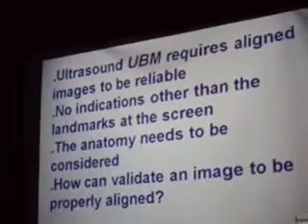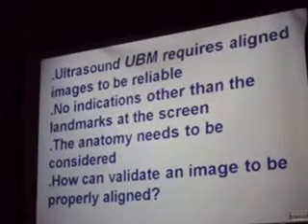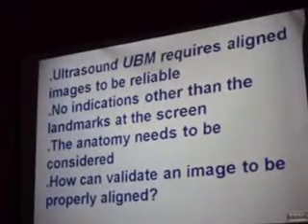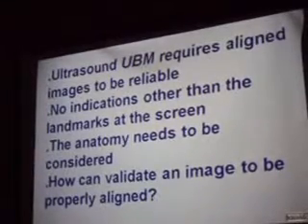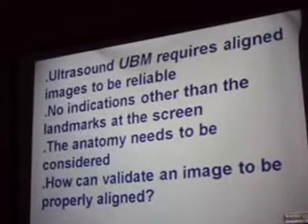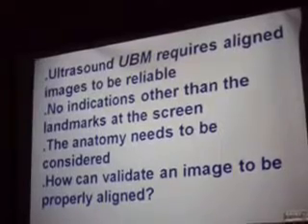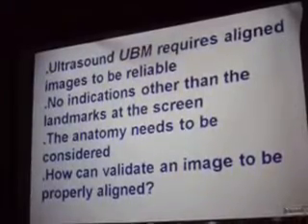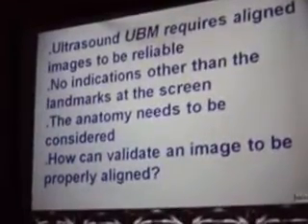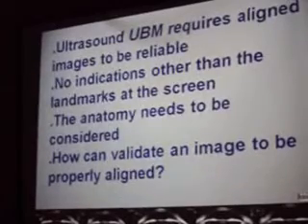Depending on how well aligned you are, you can have a lot of information that is not accessible to other media. But if you are not properly aligned, you're probably going to draw wrong conclusions because you're going to take wrong measurements. You're going to get confused about what you are seeing on the eye. There are no other indications that you are properly aligned than looking at the picture.